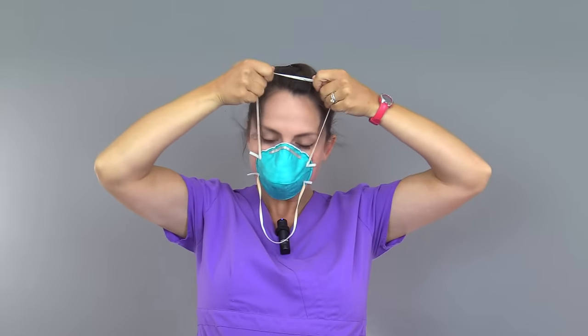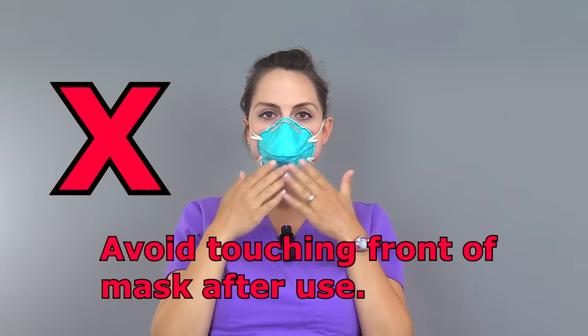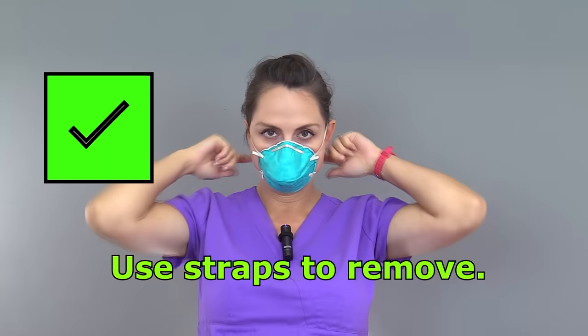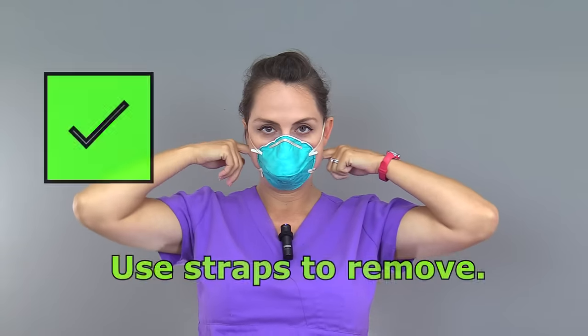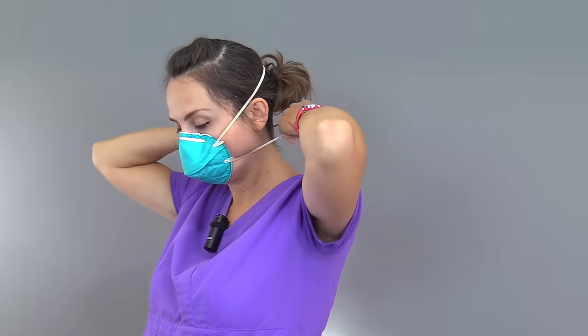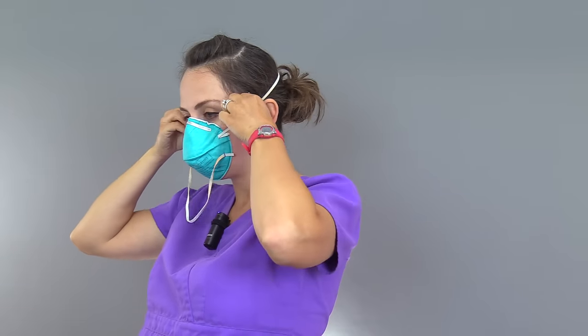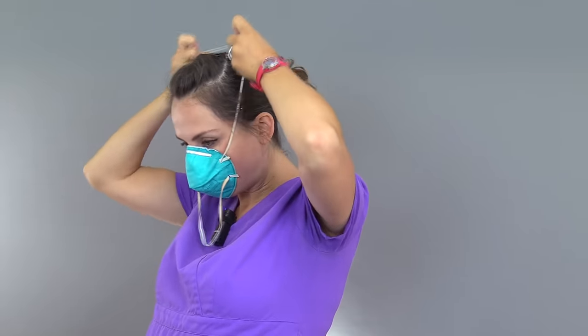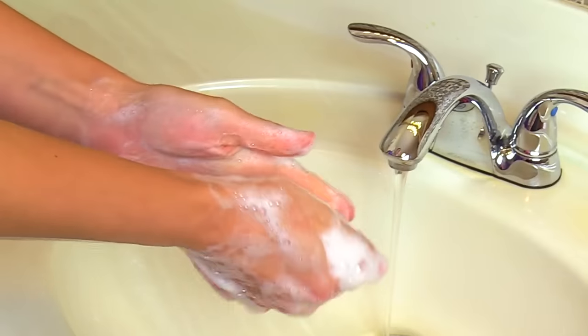Now to doff or take off the mask. Two things to remember: you don't want to touch the front of the mask because it's considered contaminated, but you can touch the straps of the mask because these are considered clean. First, remove the bottom strap by pulling it over the head. Then take the top strap and pull it over the head. Be very careful not to touch the mask. Now you can dispose or reuse the mask depending on your facility's protocol, and then perform hand hygiene.